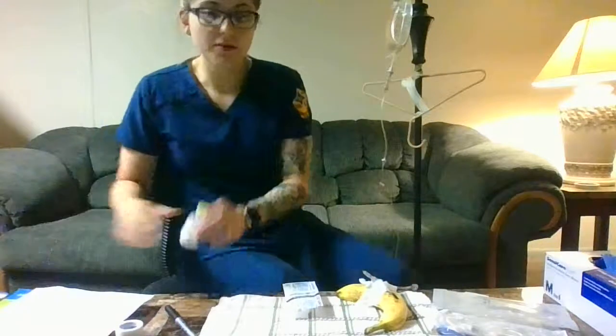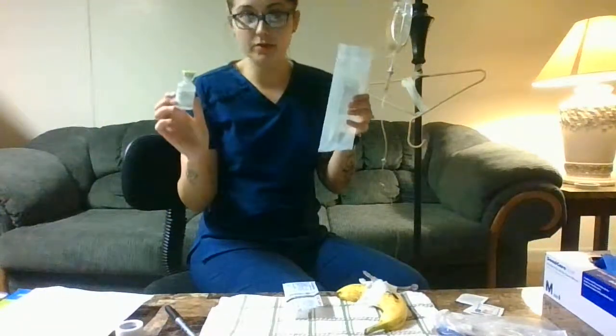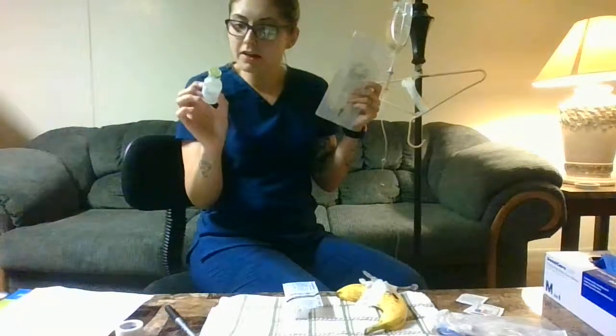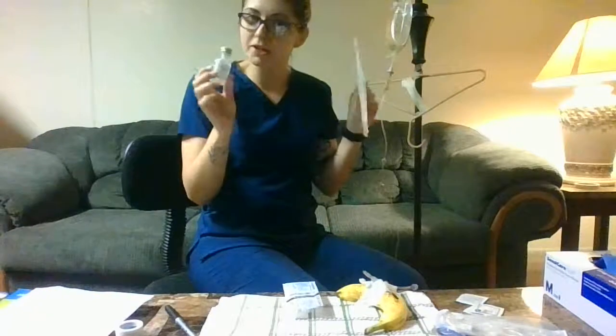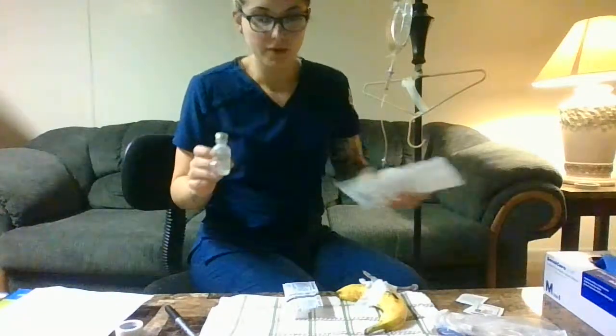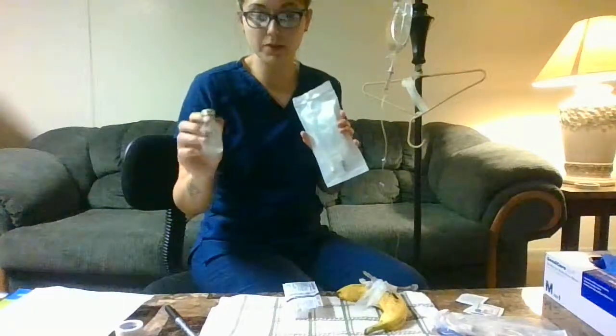Okay. So then when we're picking these out, we want to check the expiration dates on both of them. Look for any particulates. Make sure this isn't leaking. Make sure it's not discolored in any way. Okay. So we have this figured out of what we're going to get.